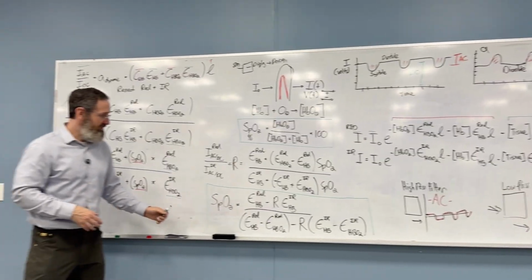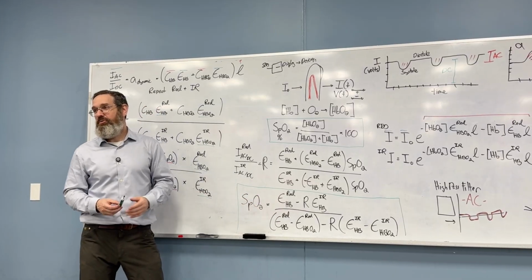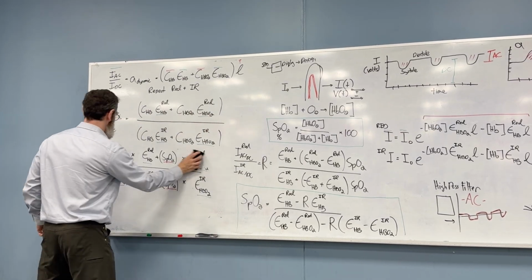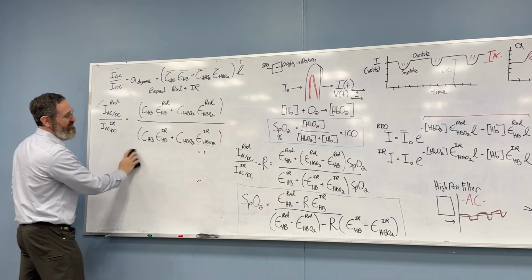Except, of course, just like with your thermistor project, the equations don't work. Because in reality, what they do in reality is they calibrate. So sorry for those of you who are paying attention.